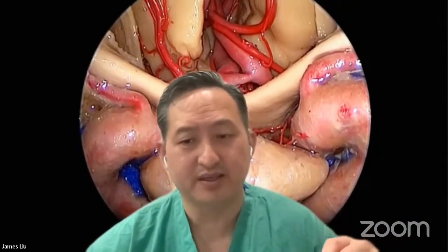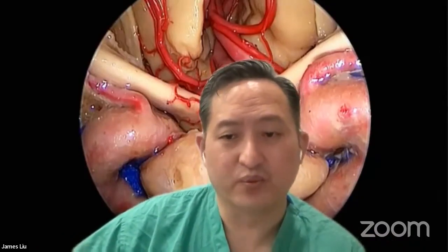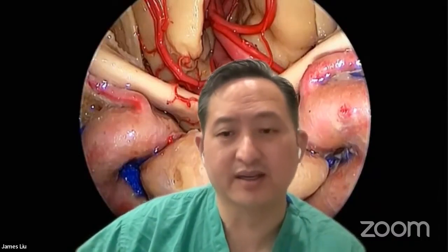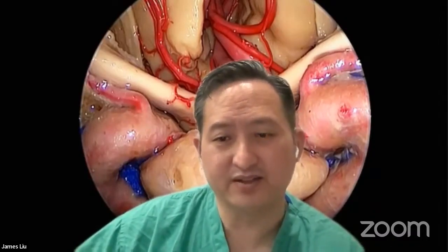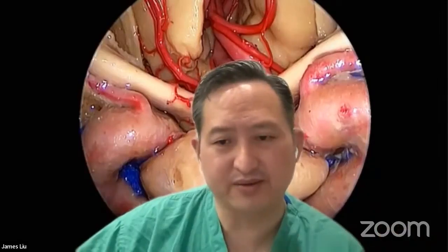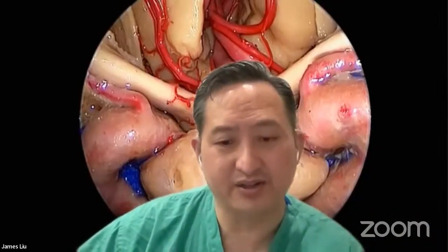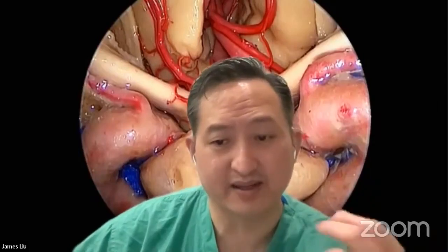And the issue here is, understand that in giant adenomas, if you get an incomplete removal, you have a very high risk of a phenomenon called postoperative apoplexy, where a partial removal results in necrosis or hemorrhage into the remaining residual tumor, because what you've done is you've woken up a sleeping giant. And there have been numerous anecdotal and published reports of patients who have herniation overnight and result in mortality. That's been well documented. And so you have to be prepared to remove the residual tumor up front.